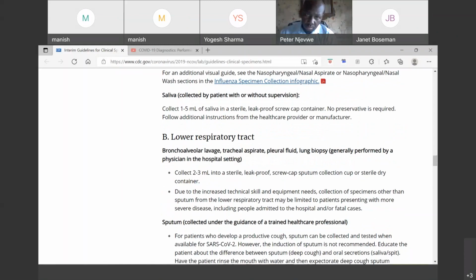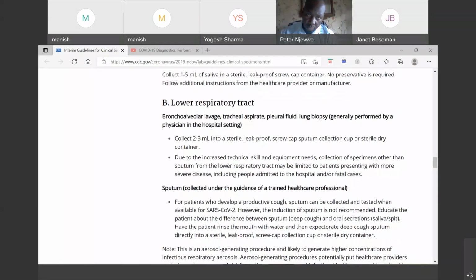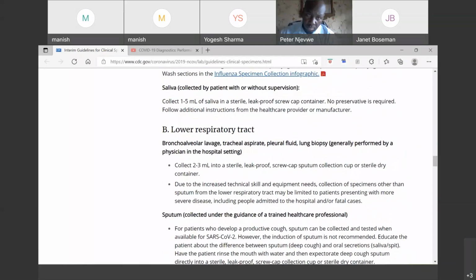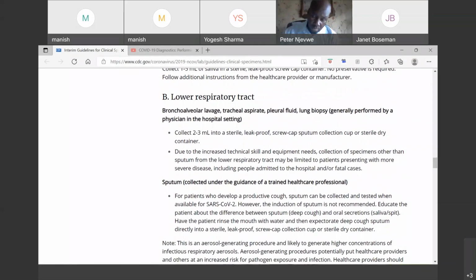Lower respiratory tract. Regarding how we collect from the lower respiratory tract, as I showed, it is generally performed by a physician. It is not for a trained swab collector. It needs a different technique to collect from the lungs, such as bronchoalveolar lavage. So it is generally performed by the physician only.